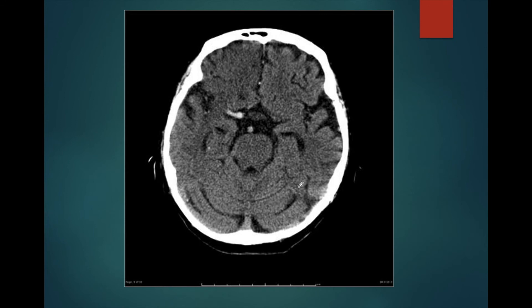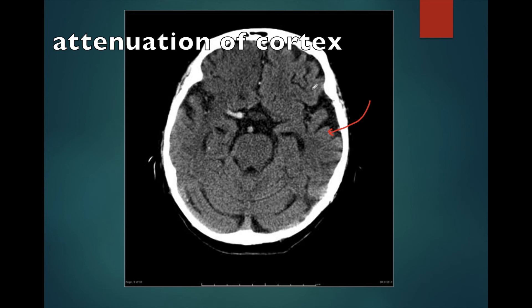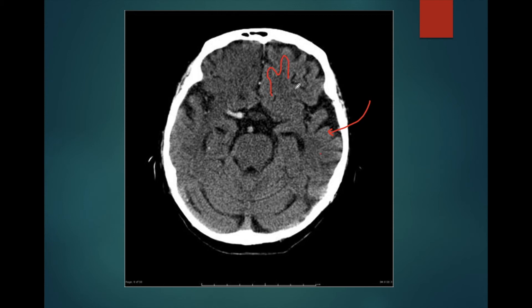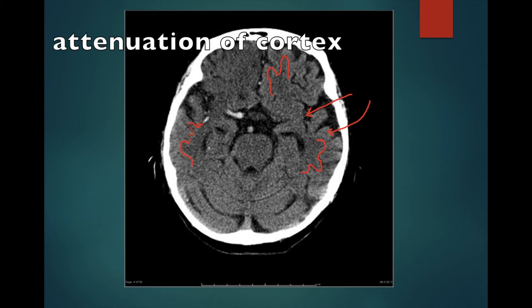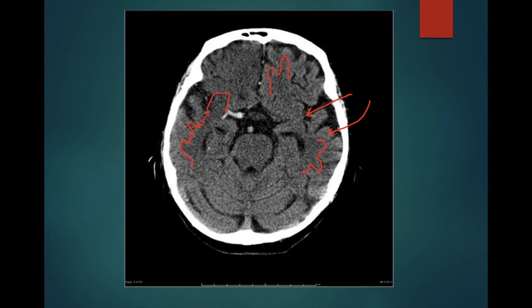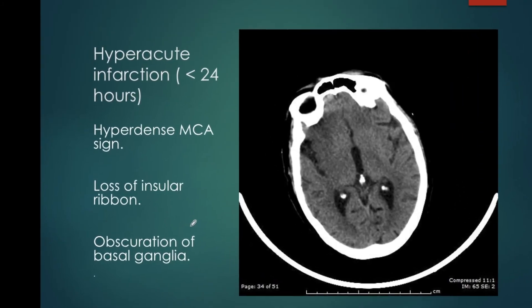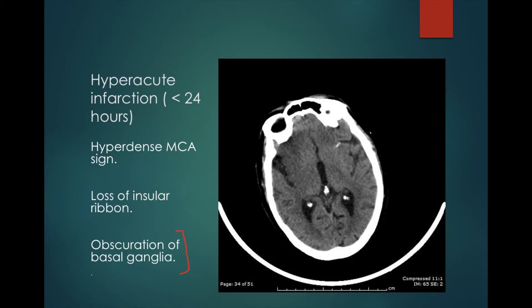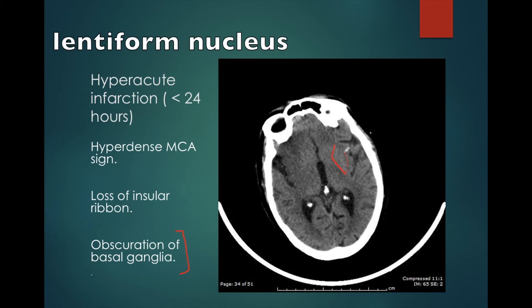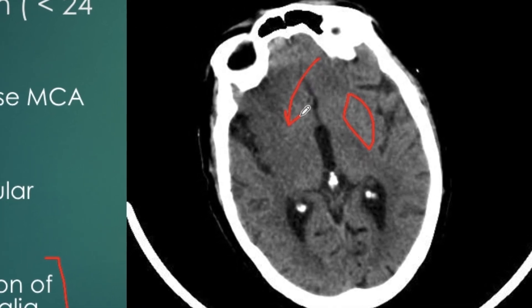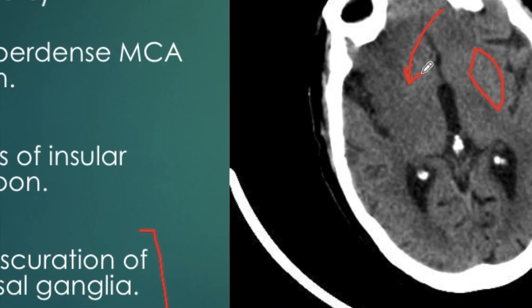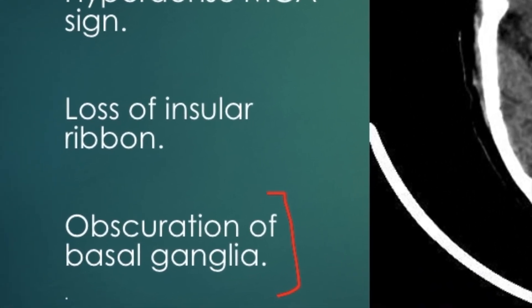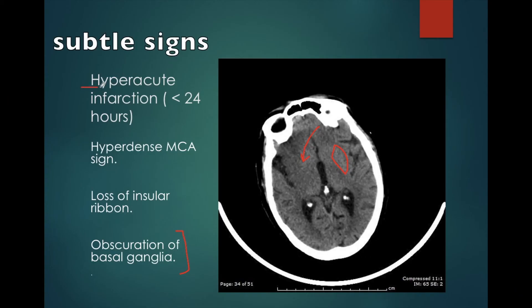We can appreciate the insular ribbon sign in this case as well. Look at the attenuation of the cortex — it is relatively hyperdense compared to the white matter on the left. But on the right side, the attenuation of the cortex is similar to the white matter, and this is the insular ribbon sign, a feature of hyperacute infarction. Another feature of hyperacute infarction is obscuration of the basal ganglia. On the left side, the lentiform nucleus appears lens-shaped, but on the right side we cannot appreciate the lentiform nucleus. This is known as obscuration of the lentiform nucleus or obscuration of the basal ganglia, and is also a feature of hyperacute infarction. These are subtle signs that can be identified only if we keep our focus on them.